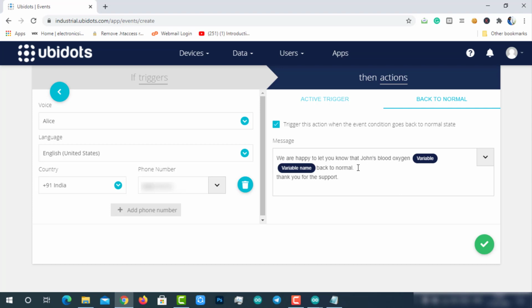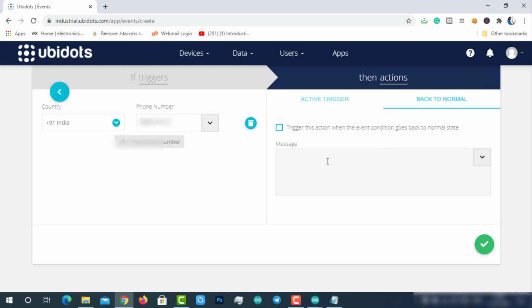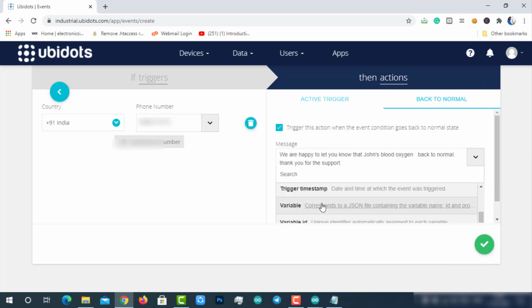then save the action. Likewise, enable the back to normal notification for the rest of the Telegram message, SMS and email alerts.